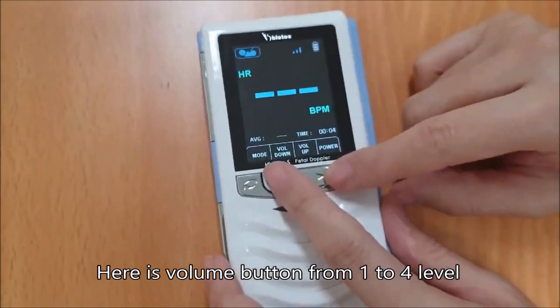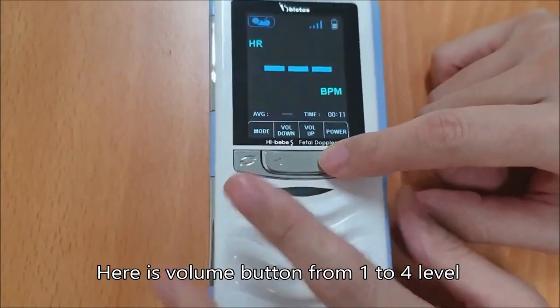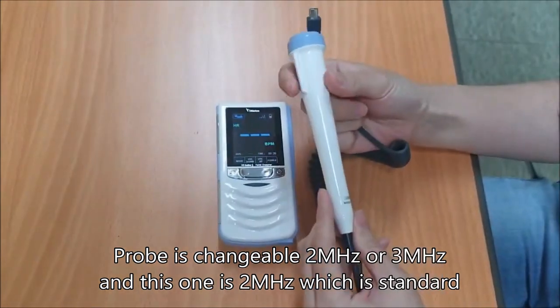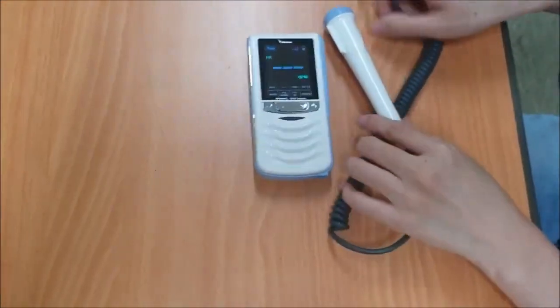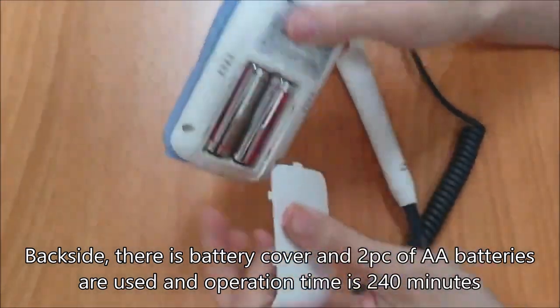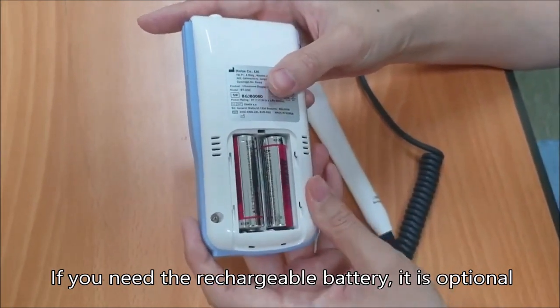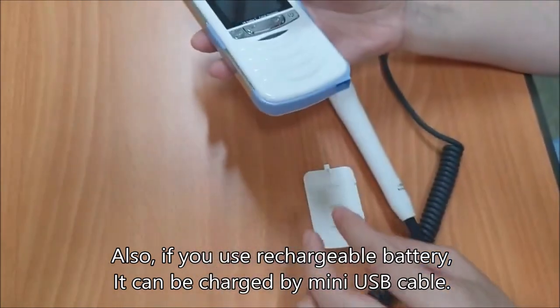Here is the volume button — down from 1, 2, 3, 4, and up. The probe is changeable: 2MHz to 3MHz, and the standard is 2MHz. On the back side there is a battery cover. Two AA batteries are used and operation time is 4 hours. If you need a rechargeable battery, it is optional. If you use a rechargeable battery, it can be charged by mini USB cable.